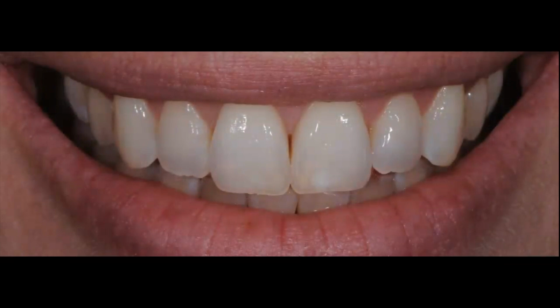At this point, the only other option that we had was a resin infiltration, but the patient did not want to go through with it. This would have been probably the 100% solution. We would probably have been able to eliminate completely the white spot, but as seen in this case, it's not only using one specific clinical procedure. You have to combine multiple of them. And my recommendation, my clinical experience after doing this for many, many years, is always to start with the microabrasion, then followed by bleaching, depending on the size of the white spot.